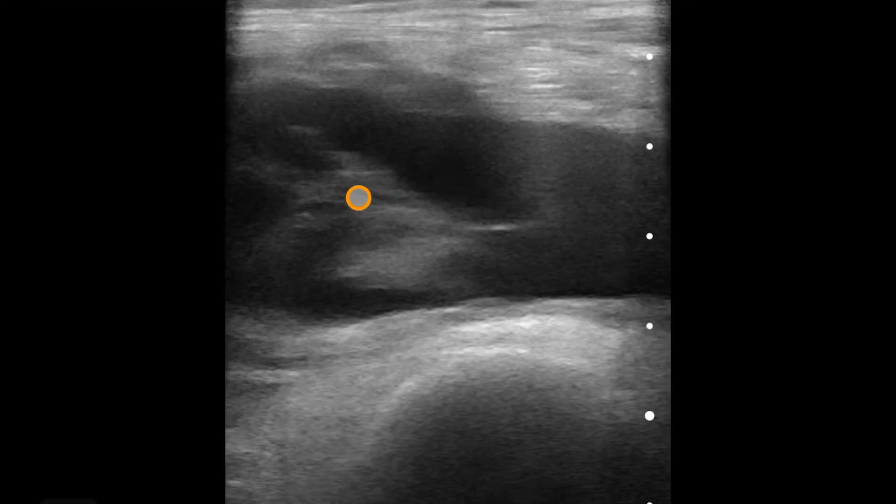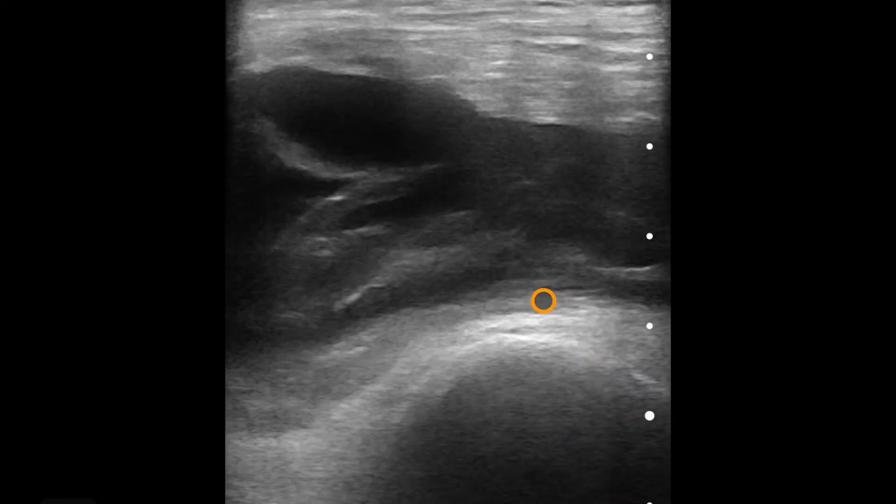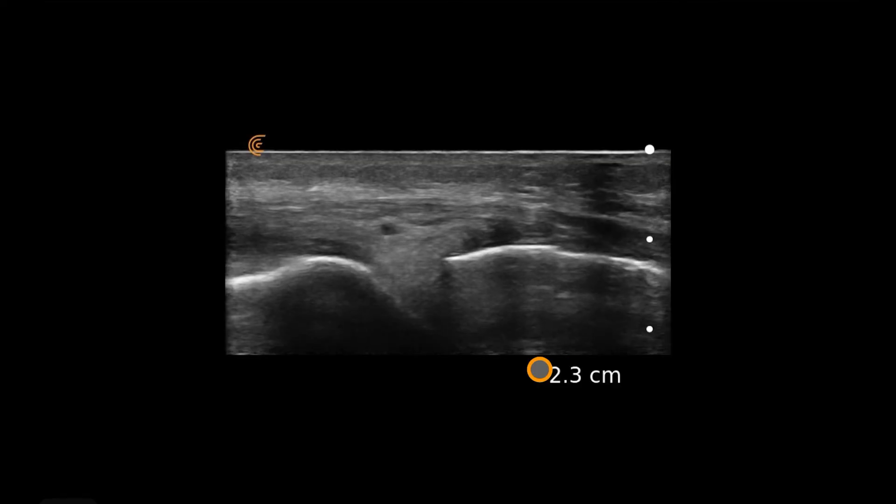In the ultrasound-guided arthrocentesis approach, we would come in-plane underneath the quadriceps tendon into the suprapatellar bursa. This would be a very successful arthrocentesis, whereas if we had gone with the traditional anatomic landmark, we would have missed entirely.